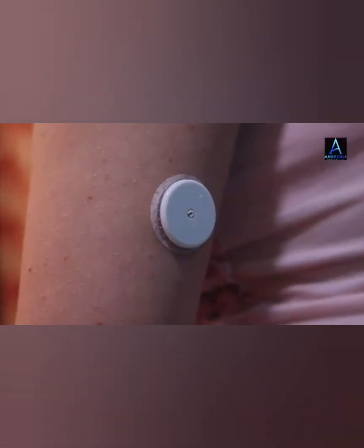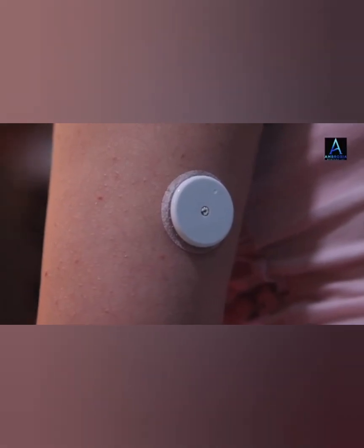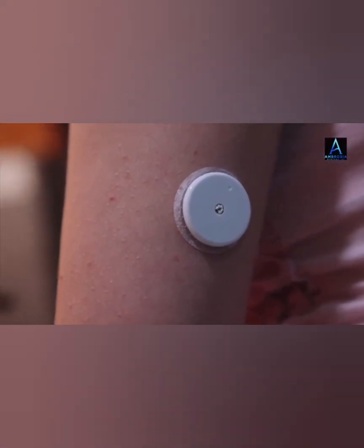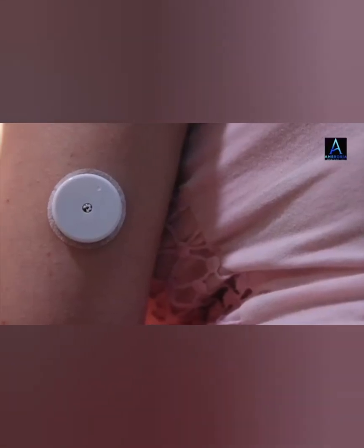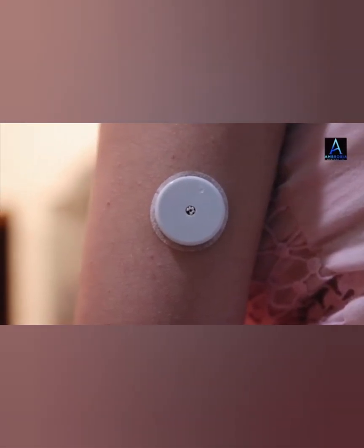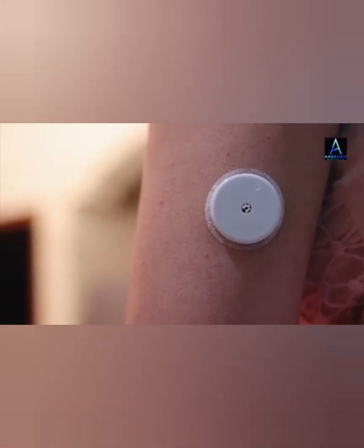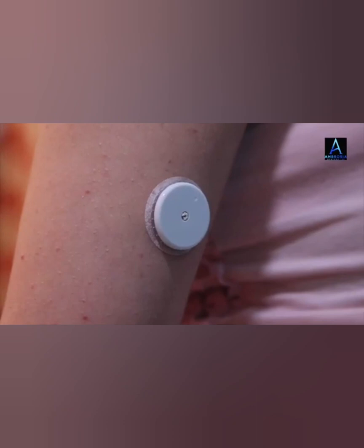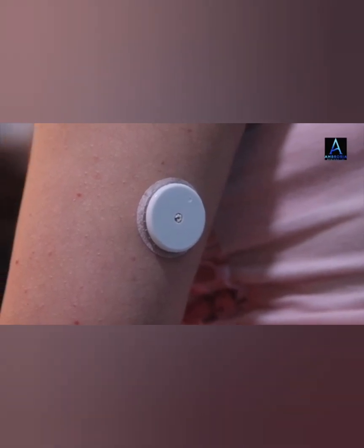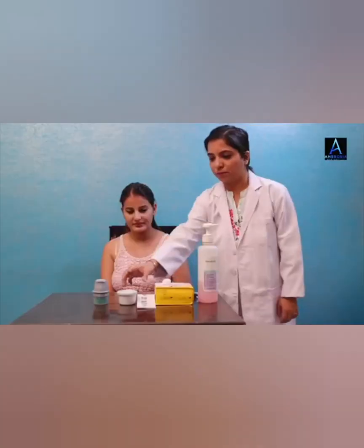This helps the sensor stay attached to the body better. Select an appropriate sensor site to help the sensor stay attached to the body and prevent any discomfort or skin irritation. Avoid areas with scars, moles, stretch marks or lumps. Select an area that generally stays flat and there is no bending or folding.